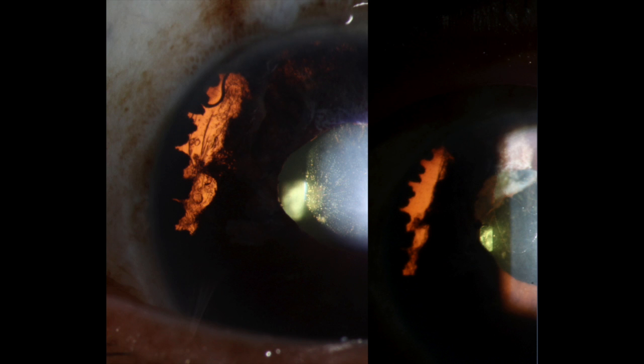If you look at the picture on the left, preoperatively, you can see the IOL haptic in the capsular bag, however, rubbing against the ciliary body. Post-op, we rotate it and no longer have that issue occurring. However, you can see the capsule is now folded in, demonstrating that area of prior zonule dialysis.